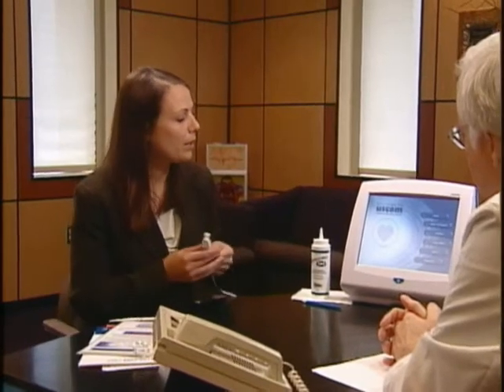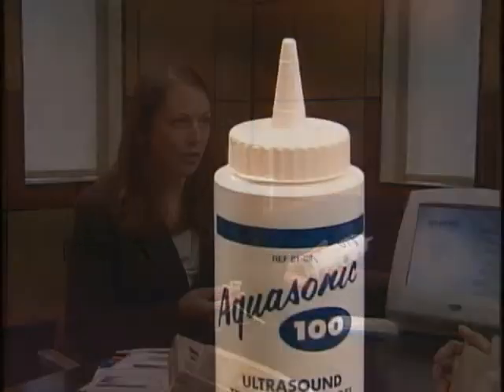This is the probe. It works in both kids and adults. It's 2.2 megahertz. All you need, the only disposable, is the gel. The probe can be placed in the suprasternal notch or the left parasternal edge. It measures flow either through the aortic valve when you place the probe here or through the pulmonic valve, so you can assess left and right-sided function with the USCOM, which makes it unique.